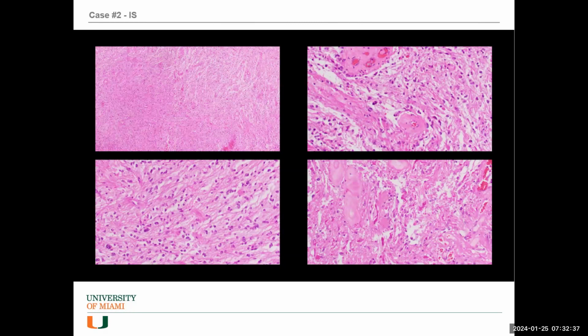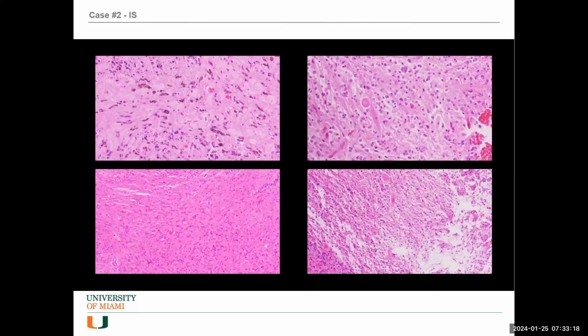Again, those are known to be associated with a pilocytic astrocytoma, but not pathognomonic because they can occur in other situations, around slow-growing lesions in the nervous system. This is within the tumor. Reactive Rosenthal fibers occur around the tumor, such as a craniopharyngioma. Okay, so Rosenthal fibers are present within the tumor. There's pilocytic morphology. There's alternating dense and loose areas, hyalinized blood vessels. Next. Of course, no mitotic figures.